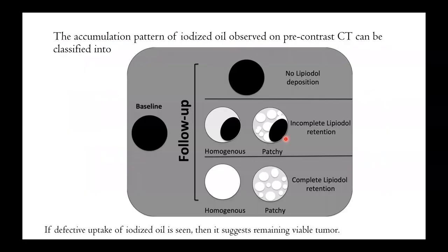The accumulation of iodized oil lipiodol is observed on pre-contrast CT and can be classified into: no lipiodol deposition, homogenous or patchy incomplete lipiodol retention, and homogenous or patchy complete lipiodol retention. If defective uptake of iodized oil lipiodol is seen, it suggests there is remaining viable tissue.